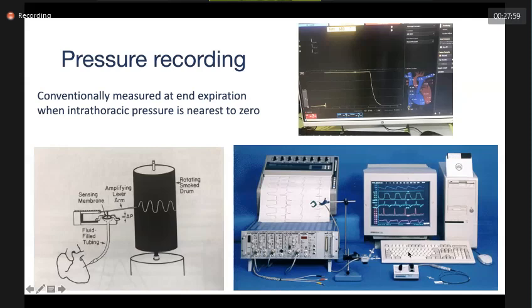with this conversion of the kinetic signals into electrical signals, and then again in the form of printing, it was developed and then worked for a long time. But it has got a lot of fallacies, with many artifacts coming even with the slightest movement of the catheter, and electrical signals which are unfiltered were giving a lot of problems.